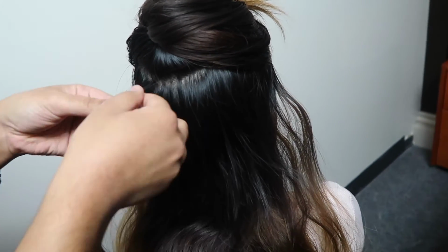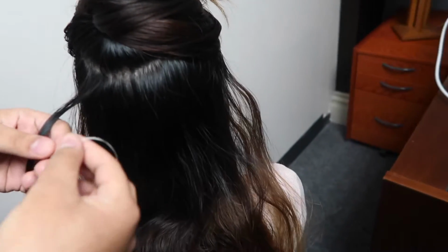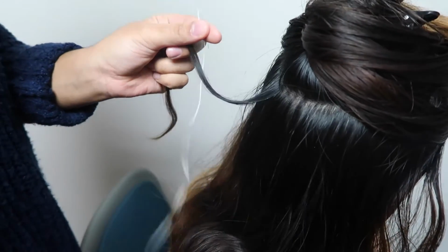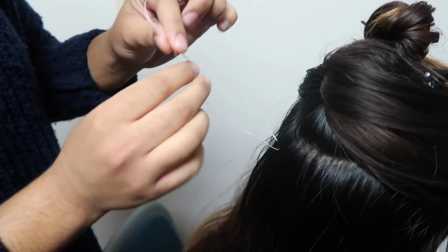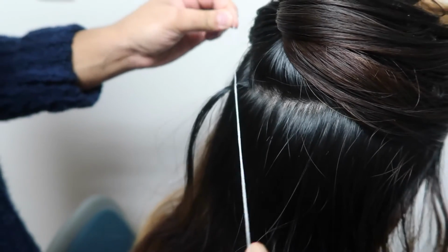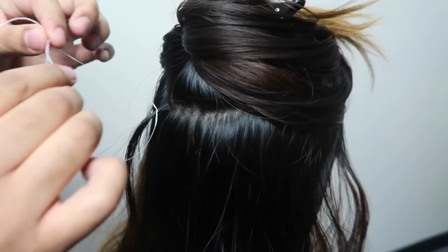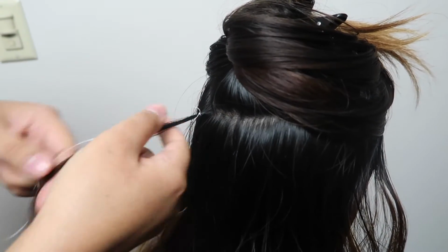So once you grab your sample and you feel like you have a good enough chunk, you're going to grab your slice or piece of string or floss or whichever you're using to tie your sample together. And you're going to want to tie a double knot towards the end, closer to the scalp, so closer to the root. You don't want to do it too close to the root, because when you eventually make the cut, the floss might fall off. So you still want to give yourself some space to make the cut when it gets to that point. So here we made a double knot around our sample.